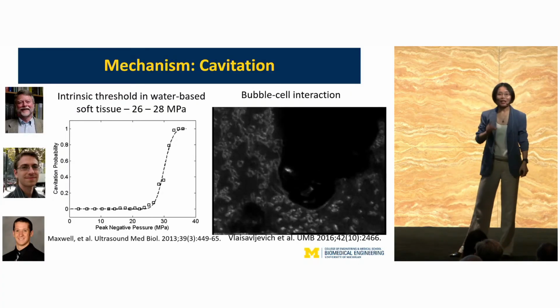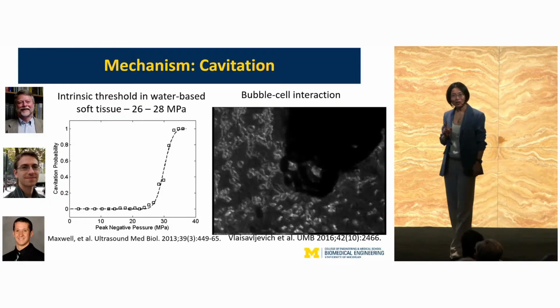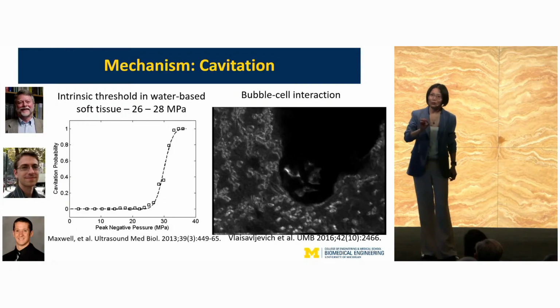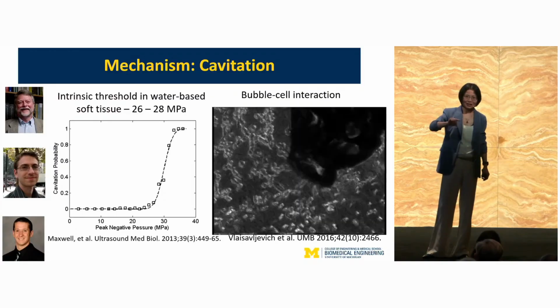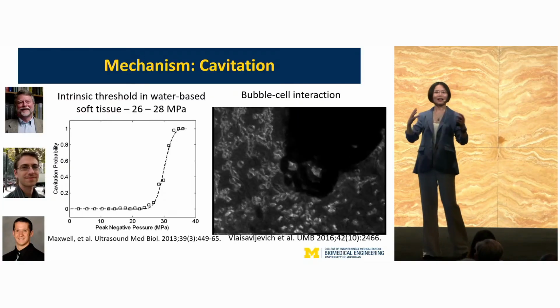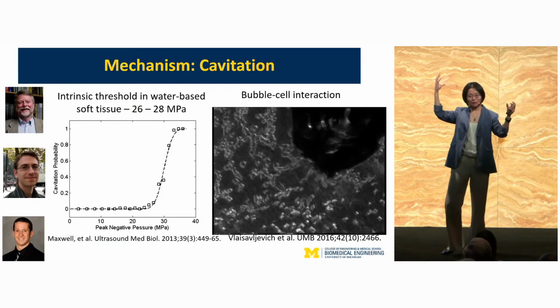Which means that if we can, within microseconds, generate over 200 times the atmosphere, but negative pressure, because remember, I need the pressure outside to be lower than the inside of the balloon, so negative pressure, then we can actually expand the gas pockets and later collapse.